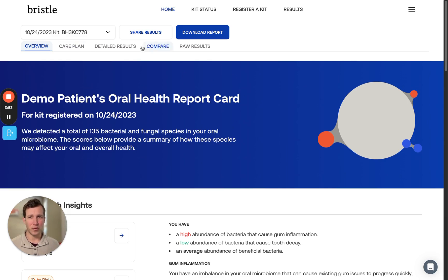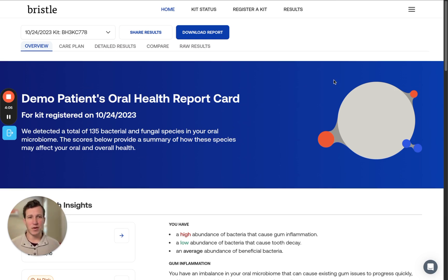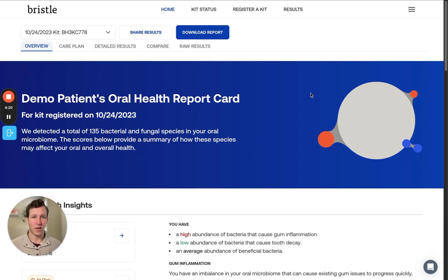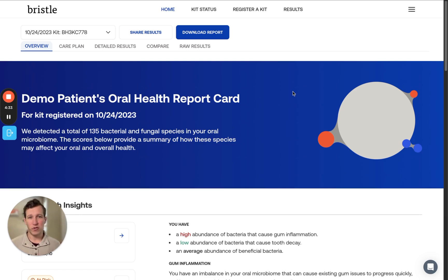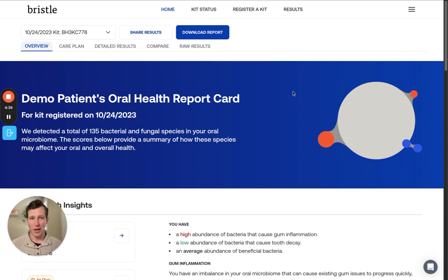The other tabs include the care plan, where we provide personalized recommendations to help you improve your oral microbiome based on your test results. Detailed results, which contains a more in-depth breakdown of the bacteria and fungi that contribute to each score. The compare tab, which will show you how your results change from one Bristle test to the next, so you can track your progress and see which interventions work best for you. And lastly, the raw results tab, which contains the full breakdown of all bacteria and fungi detected. Our algorithm takes all this information into account when creating your report card, and we usually only recommend looking at this if there are particular bacteria or fungi you're interested in, or if you're a microbiology nerd like us.